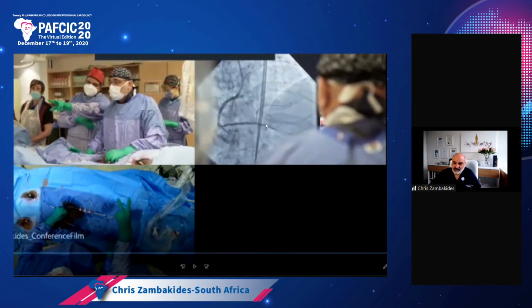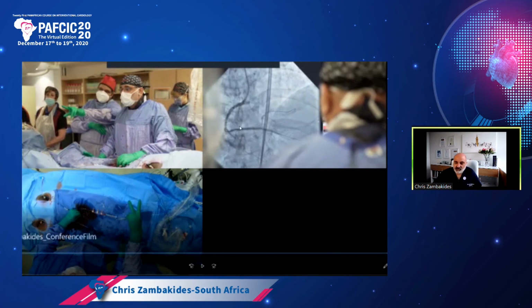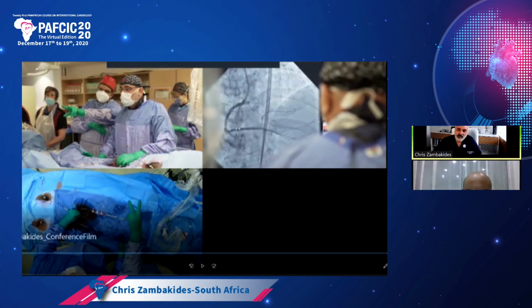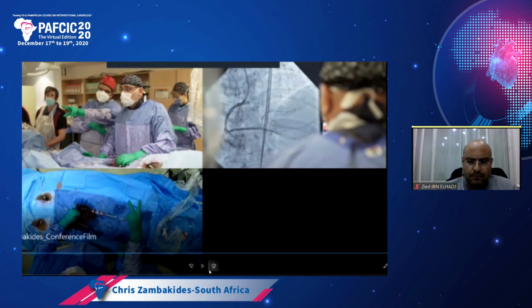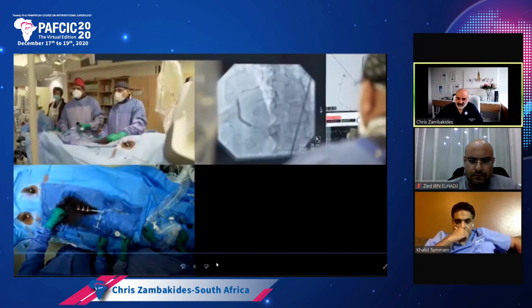So we stented from here because it was so diffusely diseased till there, and stented with another 2 stents going back. The IVUS showed that the stent that was placed before was only about a 2.75 to 3 millimeter stent, but the vessel was actually 4. So we went with a 4 non-compliant balloon to high pressures. That's the final stent going in.